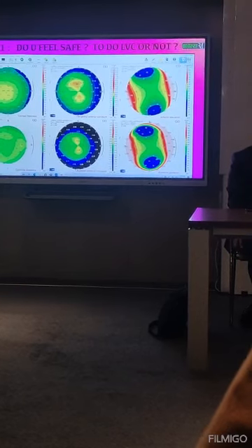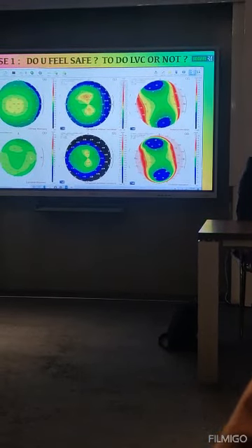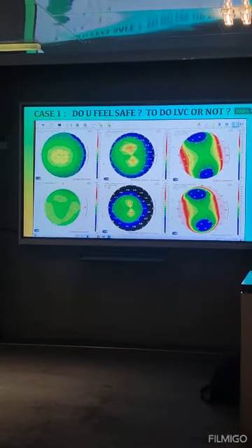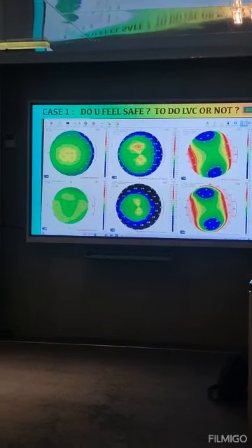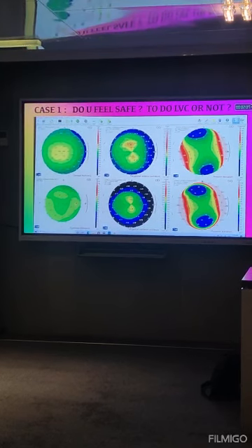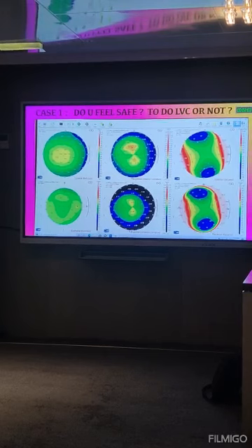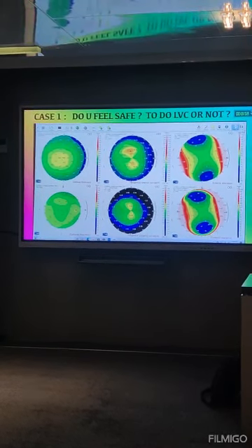It's not bad. Look at the epithelial thickness. There is no thinning in the center. It's a very thin cornea. This is the thing. The central part of the cornea, epithelial thickness is 54 and 55, and surrounding is around 57, 56, which is good. There's no problem regarding the epithelial map. It could be a normal thick cornea. It could be, but it's not keratoconic cornea.